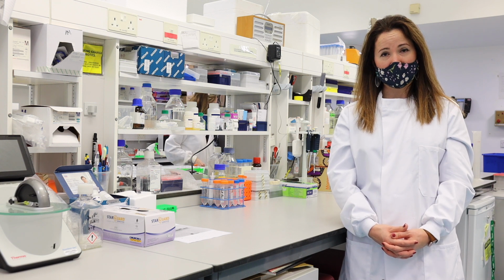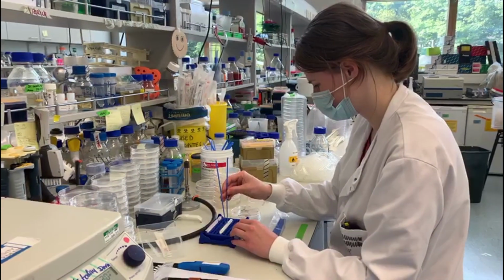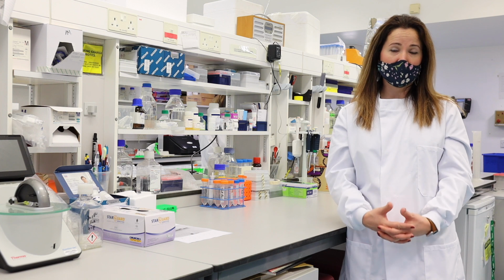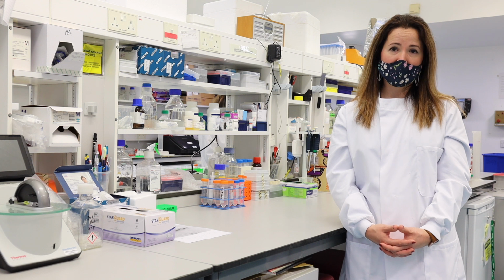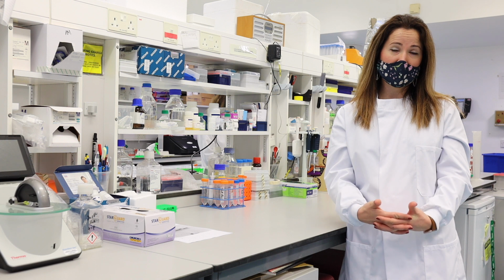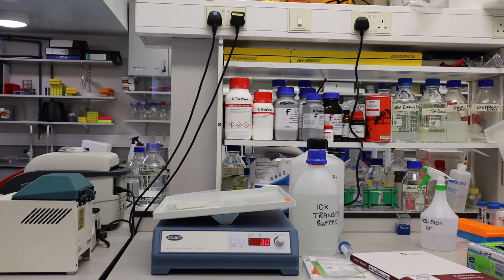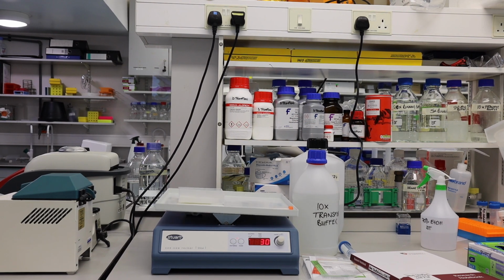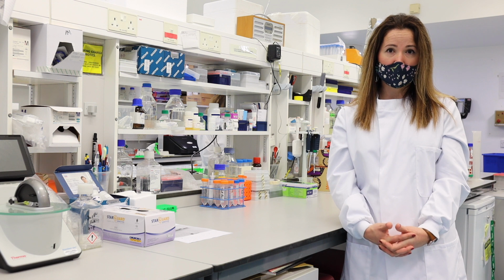One of the problems at the moment is that the current tests were never developed against SARS-CoV-2, but just coronaviruses. What we are finding in our work is that these tests are not specific or reliable, because when we test some of the common cold samples, for example, they also come through positive. So we are really hoping that by the end of this year, we will have a functional test that is not just reliable, but also very specific against SARS-CoV-2.